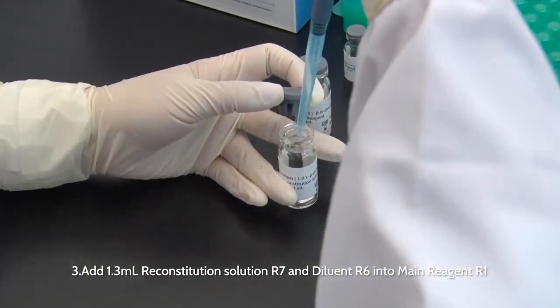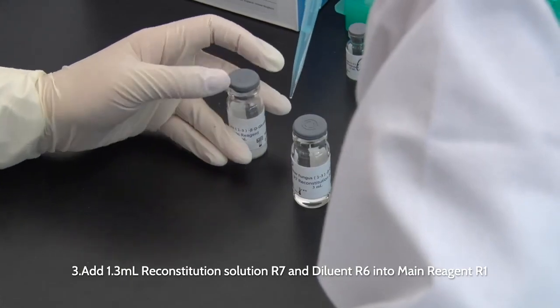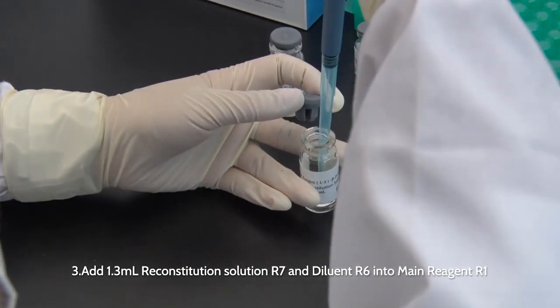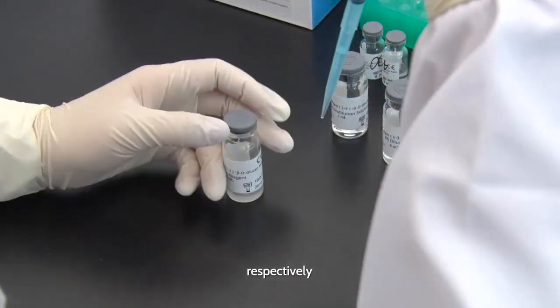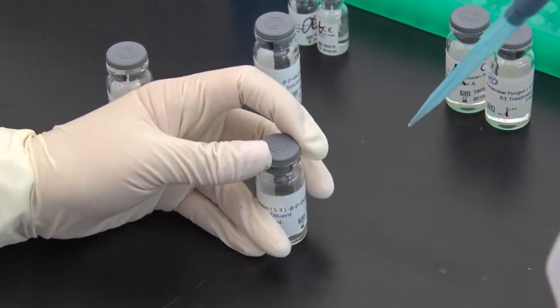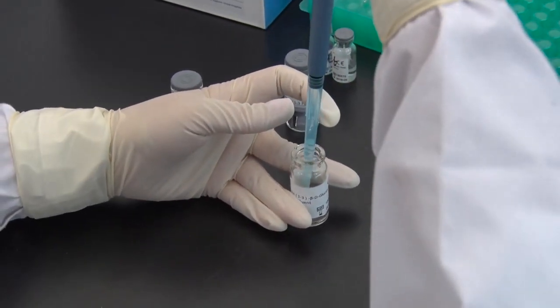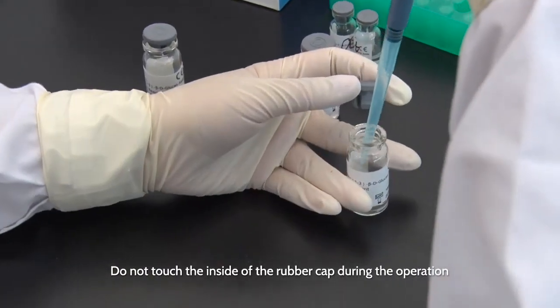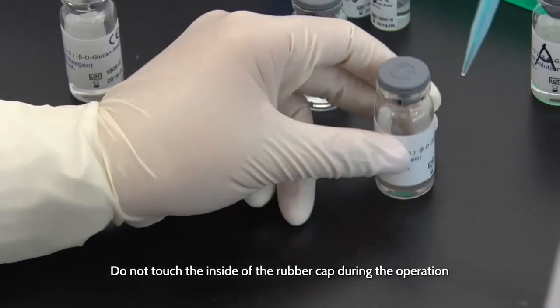Add 1.3 ml reconstitution solution R7 and dilute R6 into main reagent R1, respectively. Add R7 before R6. Do not touch the inside of the rubber cap during the operation.